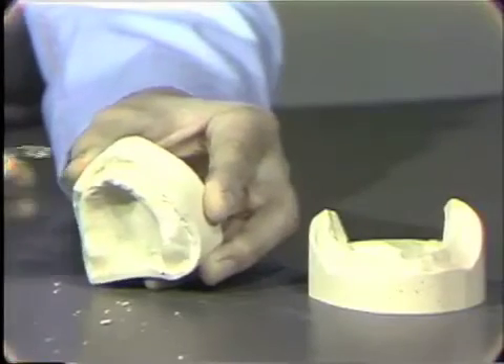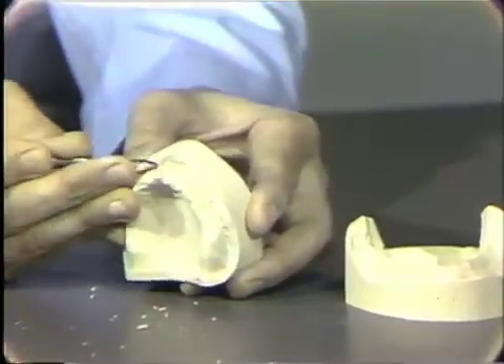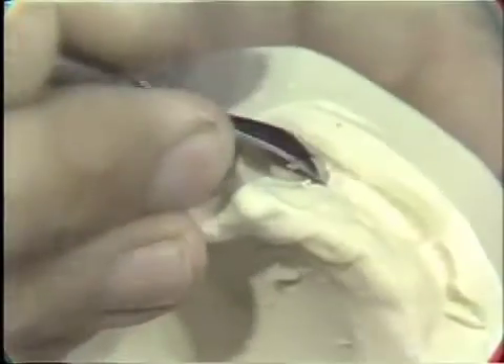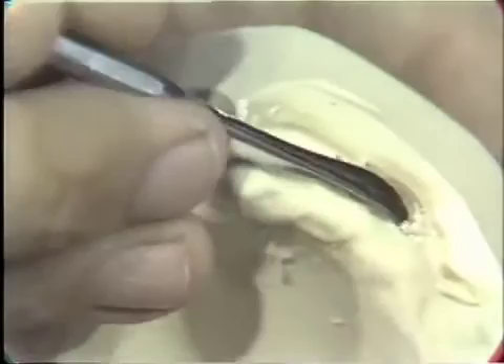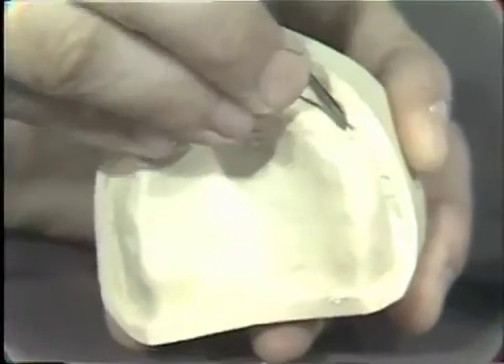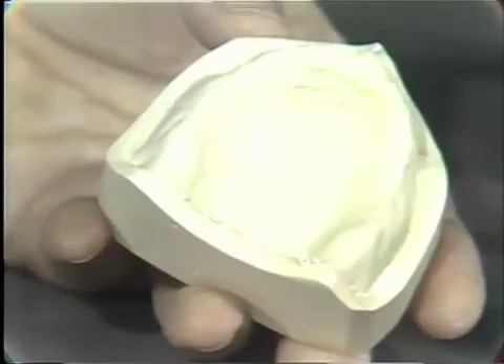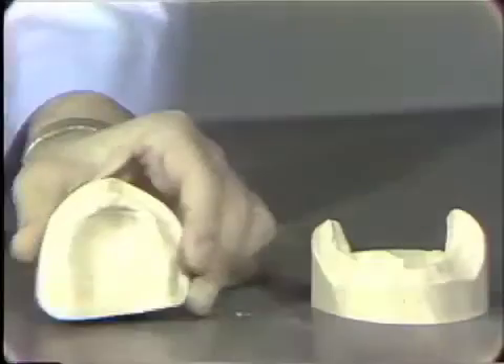Now, if I turn this toward you, you can see that down into the depths of the flanges here, we also have a few little imperfections, and those can again be carefully removed in this area. Once you have removed the majority of these, you can then take the gauze cloth and wipe these imperfections off, and proceed to perform the same on the lower model.